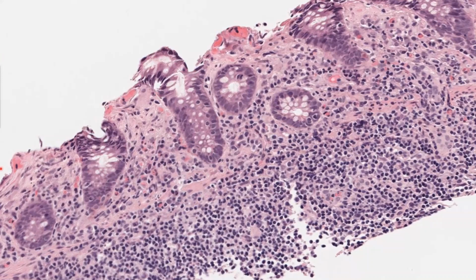The pink color is mainly present here in this zone. But when you go down, it is more of inflammatory cells, but without that pinkness, right? So that pink is gone here, but it is present here, and it is pushing the inflammatory cells away. So that is one thing that we need to focus on.